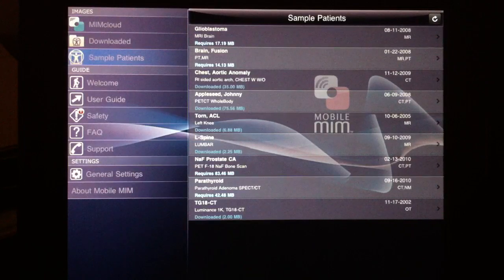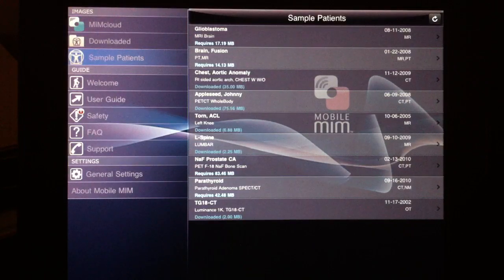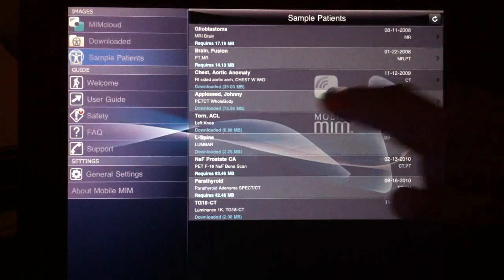There is an area for sample patients. This is very useful, and you can see quickly the type of studies that are available and the capability of this application.